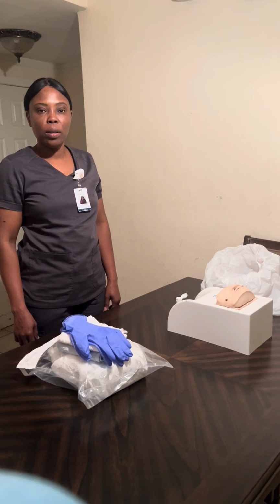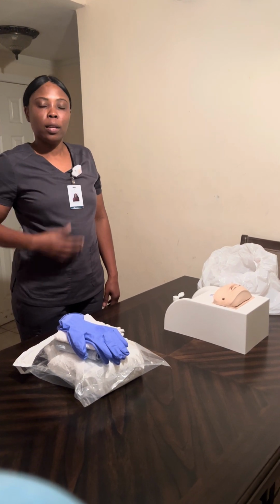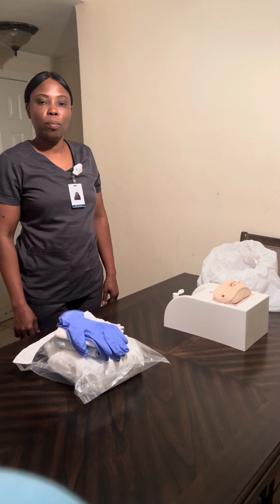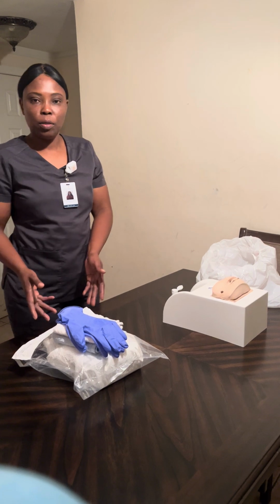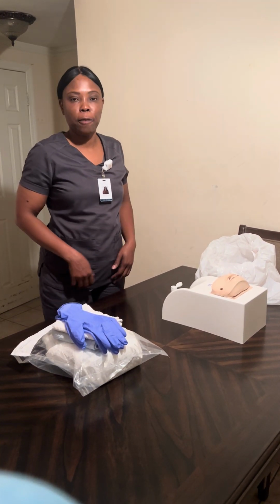Today I'm gonna perform insertion of Foley catheter. This is my school ID. This is my uniform, but it's not the school uniform because I didn't receive it yet. This is my equipment. This is my patient. This is my hand sanitizer. This is my garbage bag.